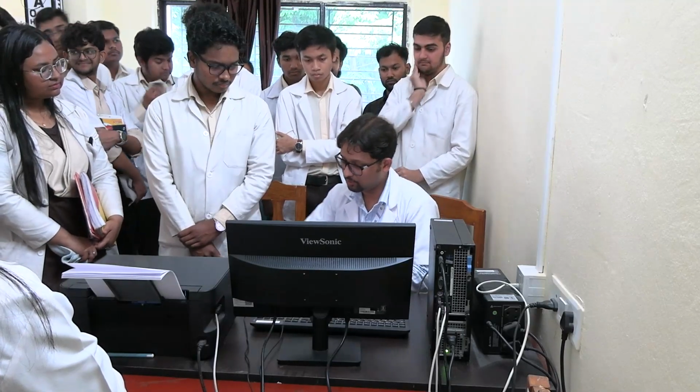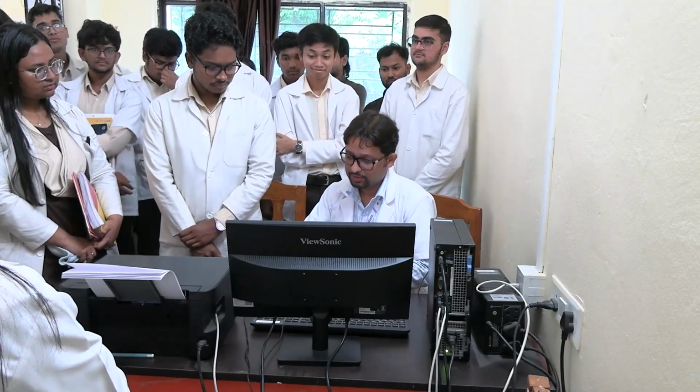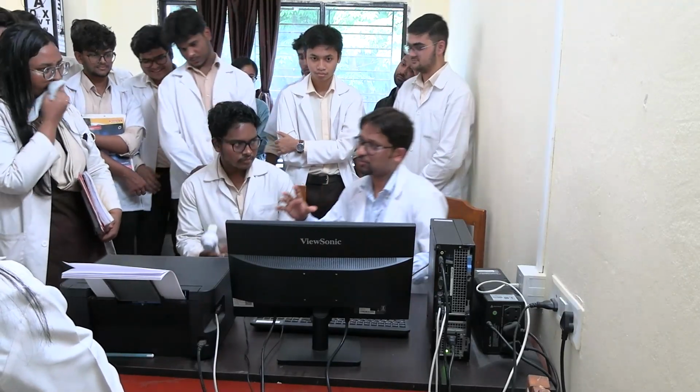Nose also can be clipped. You have nose clips like this, but if they are not tight enough, you can use your own fingers also for clipping. Because this has to be done against your own standards. Now you follow what I am doing.